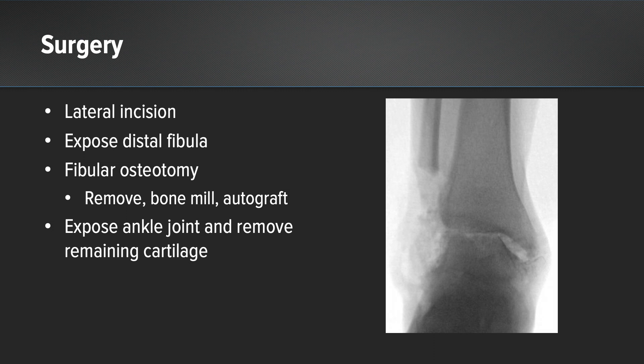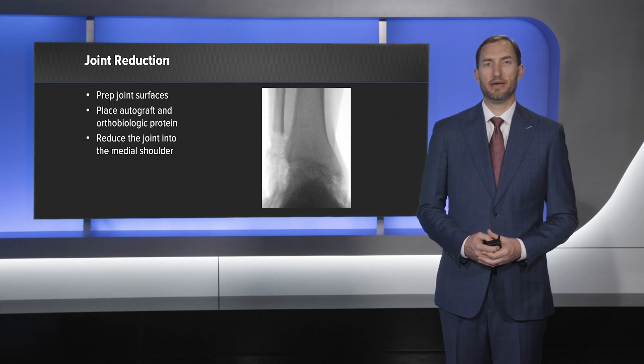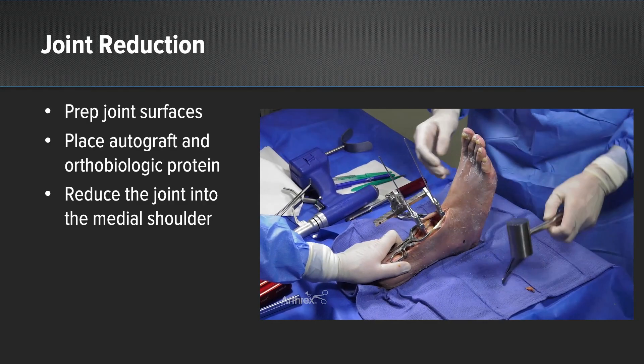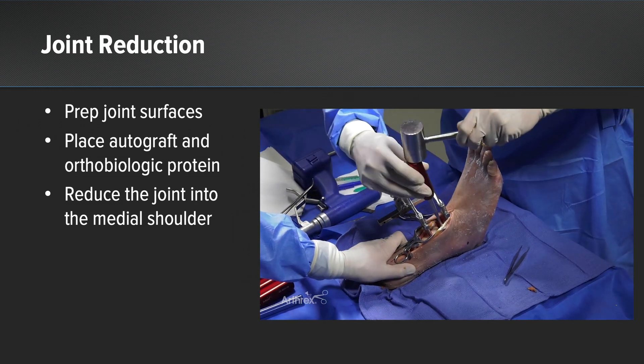Then I exposed the ankle joint and removed any remaining cartilage. I then prepped the joint surfaces and placed autograft and an orthobiologic protein into the fusion site. I reduced the joint using the mini joint distractor compressor and placed the talus into the medial shoulder of the ankle joint.